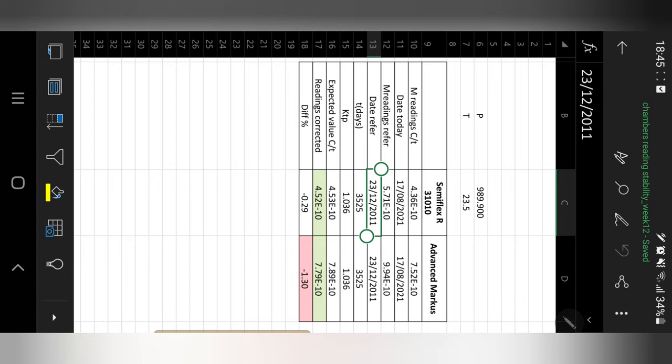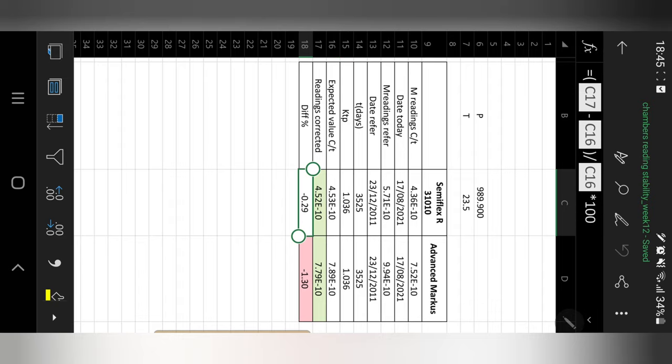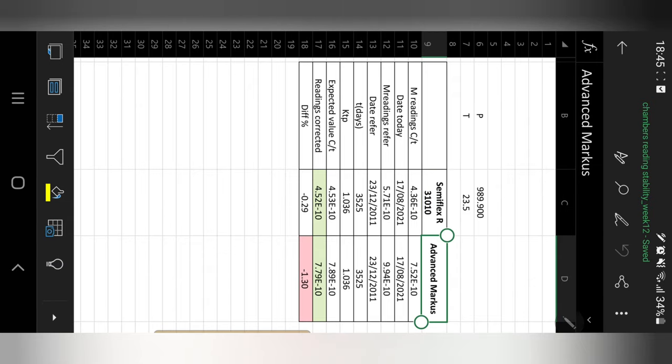The difference between today's date and the date when the source was new gives us the number of days that have elapsed. Applying the decay equation, we obtain the expected value. Comparing that expected value to today's measurements gives us a percentage difference of 0.29% for the Semiflex and 1.3% for the Advanced Markus.